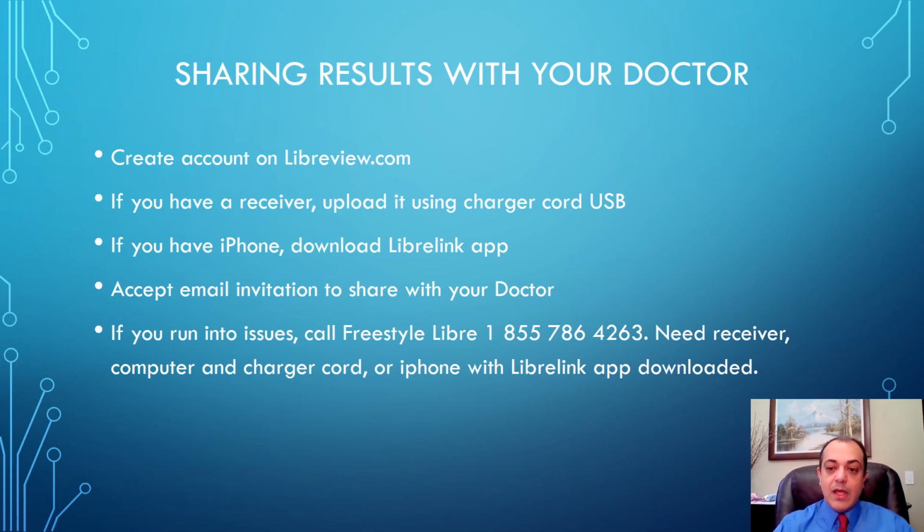So for example, in clinic, if you are trying to get the results from a patient and the patient has not created an account on libreview.com, which is the very first step, you cannot get the results because they are not linked. If they created the account, which is step one, but they have not uploaded the results from the receiver to the computer, again, you cannot connect with them, you cannot see their report. If a person has an iPhone, but they haven't downloaded the Libre Link app, again, they cannot use that to share the report, and so on.